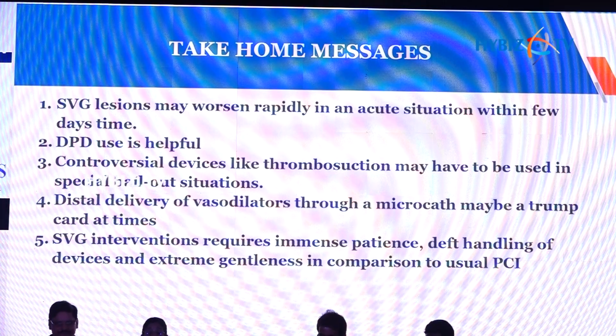So the take-home message was that the SVG lesion, as in my case, worsened rapidly. So in 1 week's time, the whole thing got occluded. So they have much more propensity to get occluded than a coronary artery, even though the patient was on heparin during this stay. So DPD filter devices are class 1, and thrombosuction in bailout situations can be used. You can even give these vasodilators through the thrombosuction device. That is a greater diameter, so better distal delivery of vasodilators is possible.